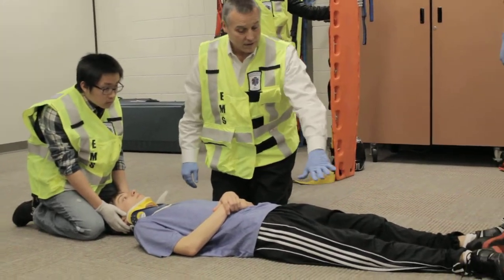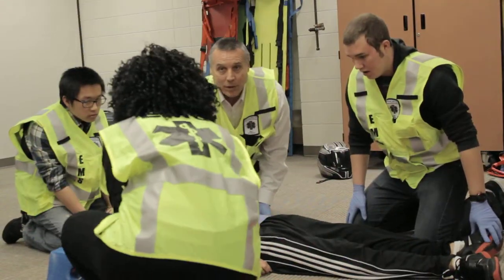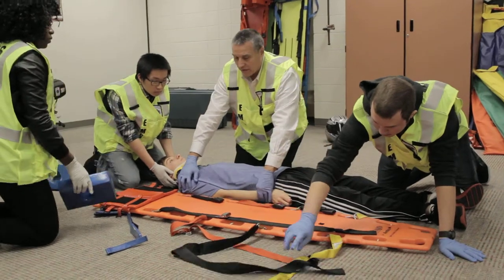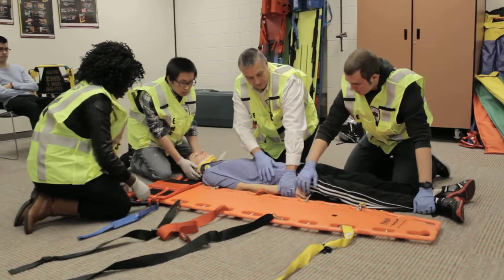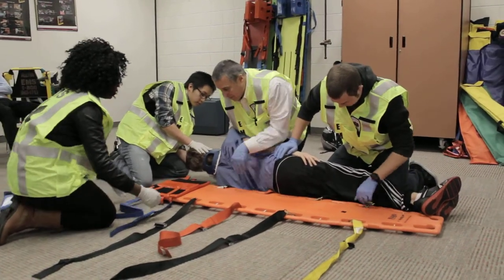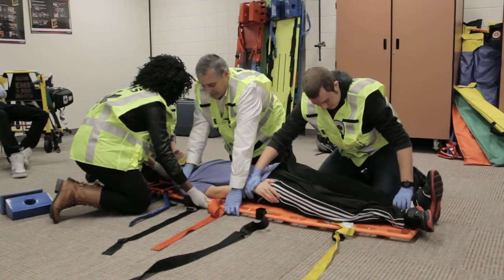I'm going to have my other partner come down here on this side. Will you lay the backboard on that side? We're going to roll the patient on his side. One, two, three — roll the patient up. I'm going to go ahead and palpate the back. Does that hurt when I palpate your back? Yes. One, two, three — patient back on the board.